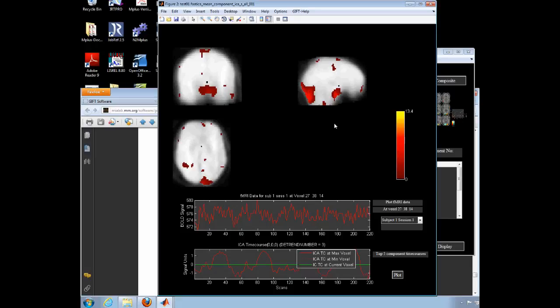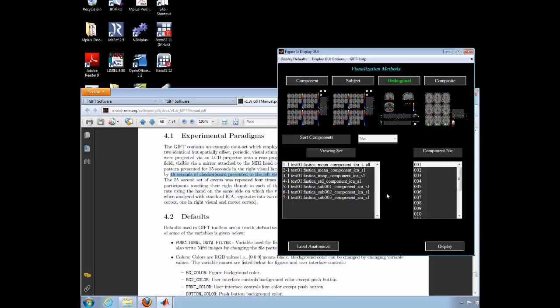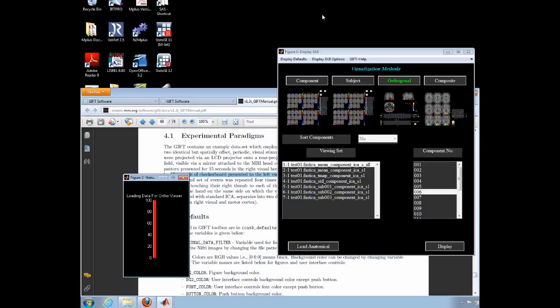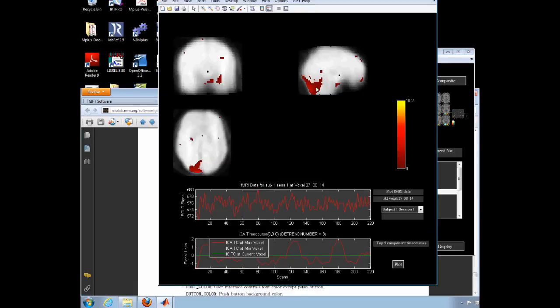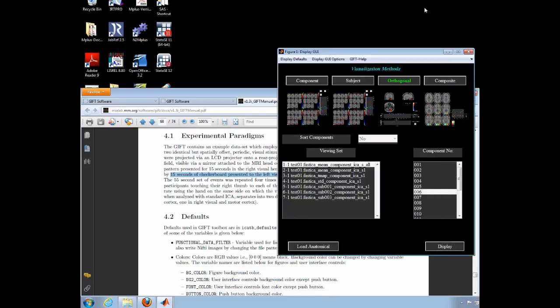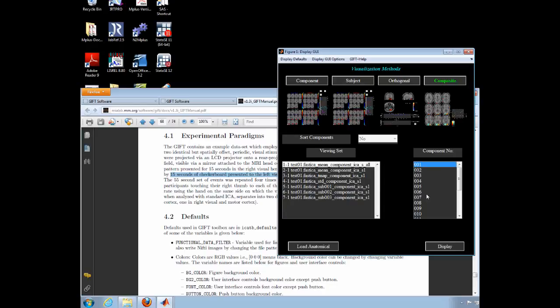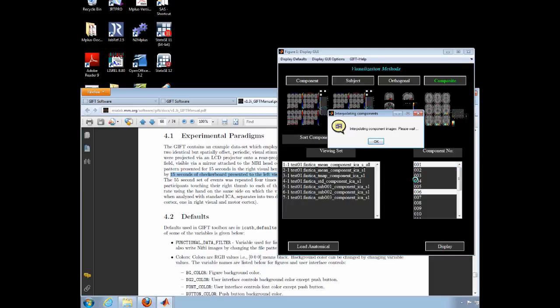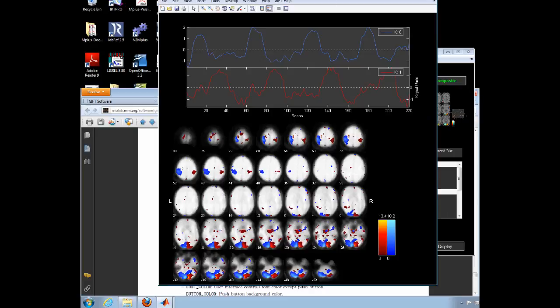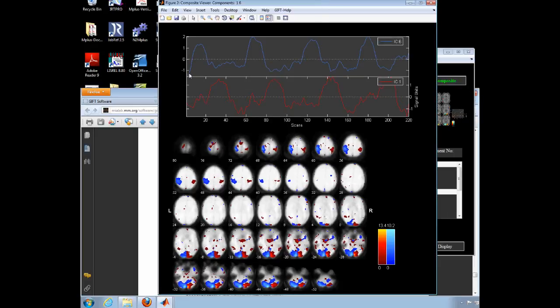Select Orthogonal Viewer and select the first or sixth component. The composite viewer is especially useful because you can map both components onto the same figure in different colors. Click on one component and then hold Command or Control and click on the other component. Then click OK. See that the time series are what we'd expect to find for this visual task presented to each visual field.